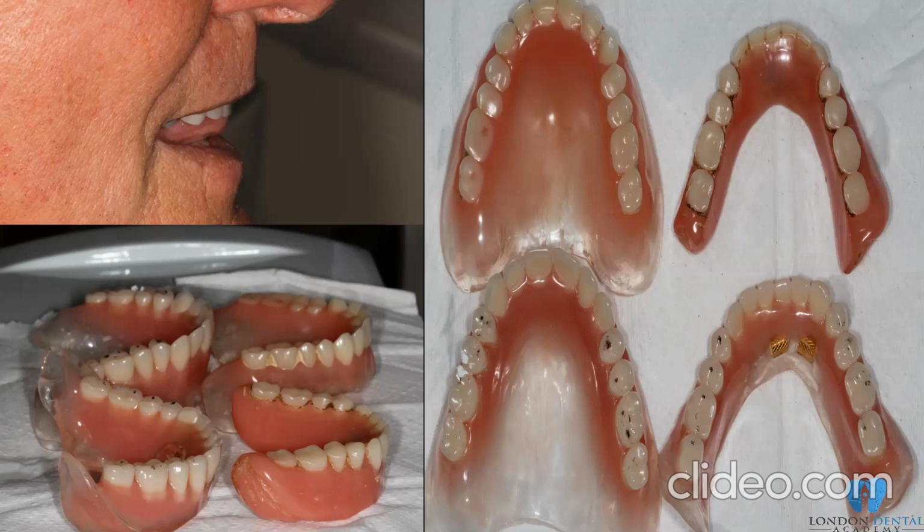If you have it engaged early, what's going to happen? You're pushing the upper teeth, especially from the palatal surface, forward and breaking the contact on the posterior, meaning that you will end up breaking the seal and losing retention. And that's most of the dentures. Most of the dentures have either contact on the canines or the palatal surface of the centrals. So having two, three small tweaks in the denture might improve your retention dramatically, and the patient will feel the difference. So please make sure you pay some attention.